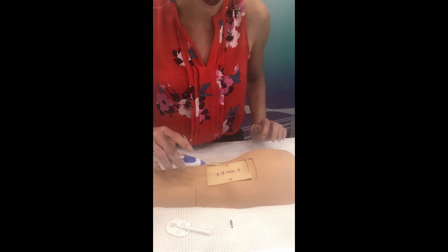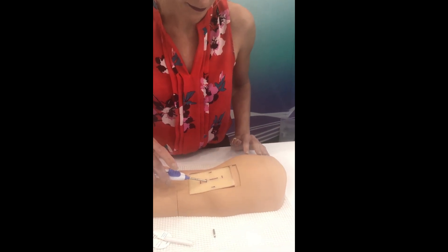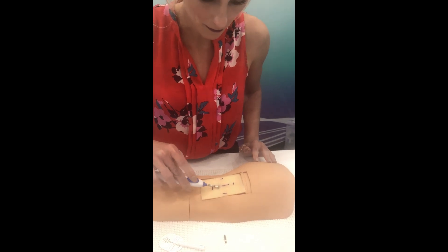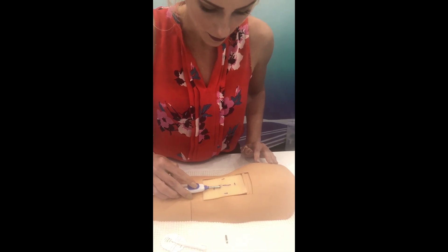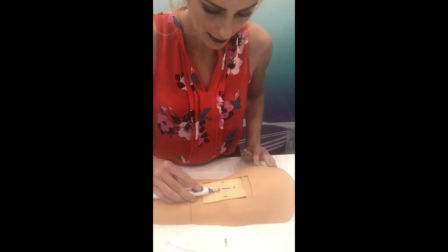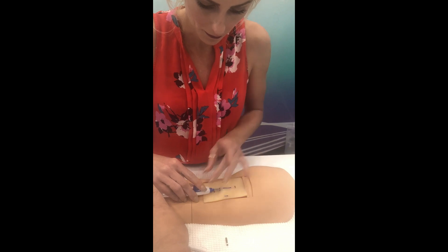Keep your hand off the blue slide for now. 45 degrees. Put it in and drop it. There you go. See? You felt that go in. So I'm in between the lines. Now I pull back. Put your hand back here.